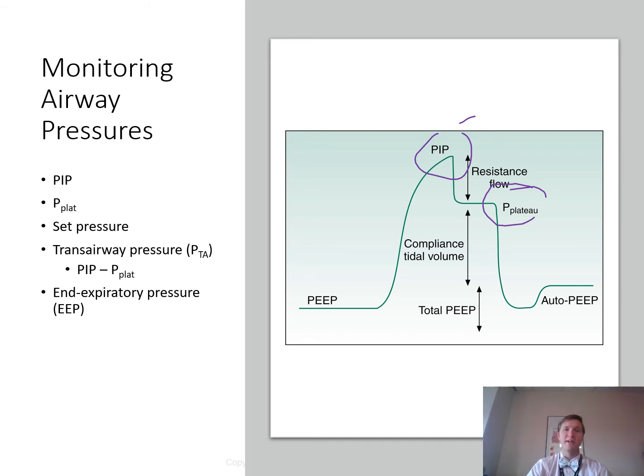Plateau pressure. Plateau pressure can be obtained using the inspiratory pause control. Usually it's about 0.5 to 1.5 seconds, and then it's read during no gas flow. So traditionally the plateau is determined where the ventilator occludes the expiratory port during inspiration, and then we're looking at the manometer. If after the PIP is reached, the manometer shows a drop of a few centimeters from the peak, then it stays in that position, that's the static pressure. So in theory, you could still do it manually, right?